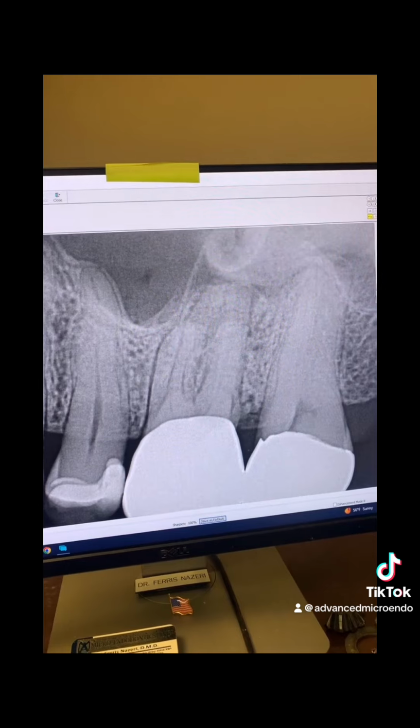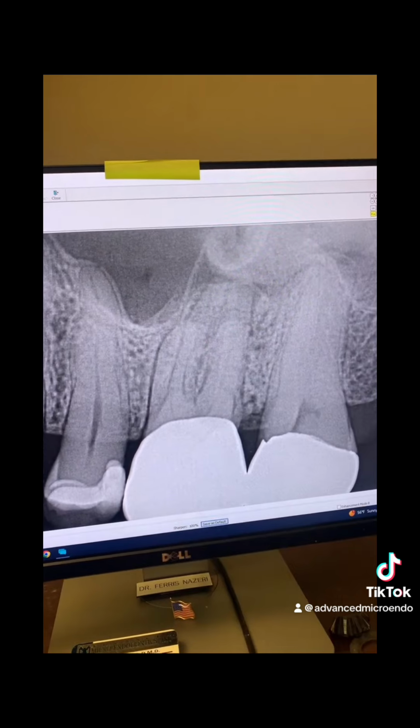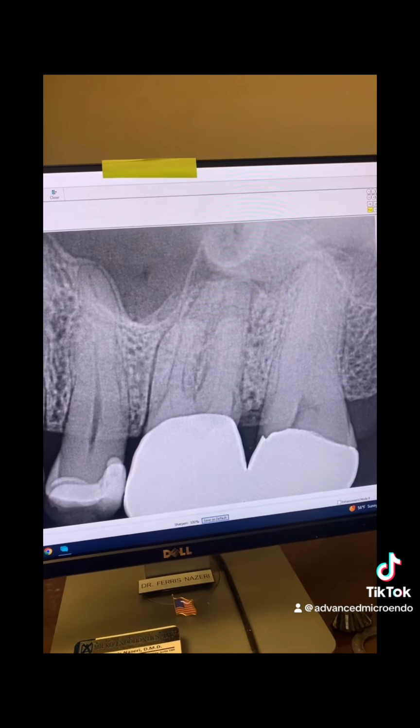So we're going to be going in to do this root canal in a few minutes.